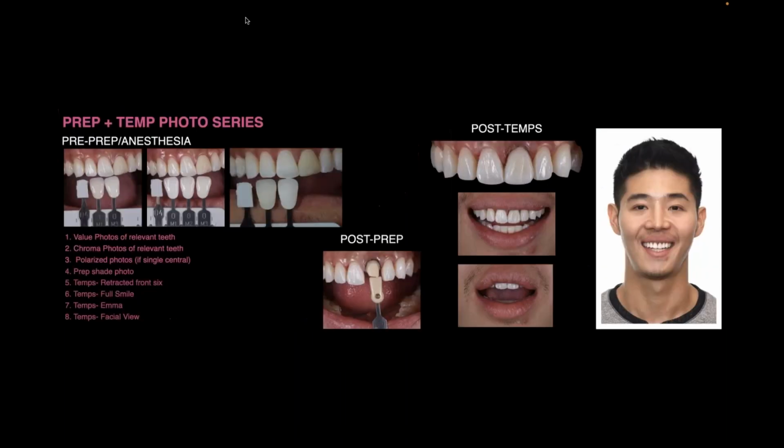Okay. Now, unlike the original photos that I showed you, which were just basic diagnostic tools, as I get into more specifics, I need to be much more clear and take a lot more photos to match a single tooth. First step, number one, is you're never taking the photos when the patient has been anesthetized or they're sitting in the chair too long.